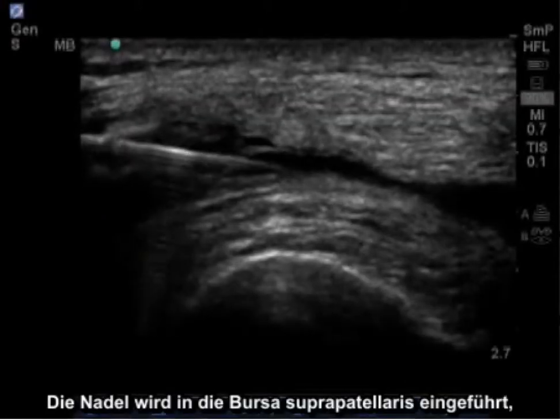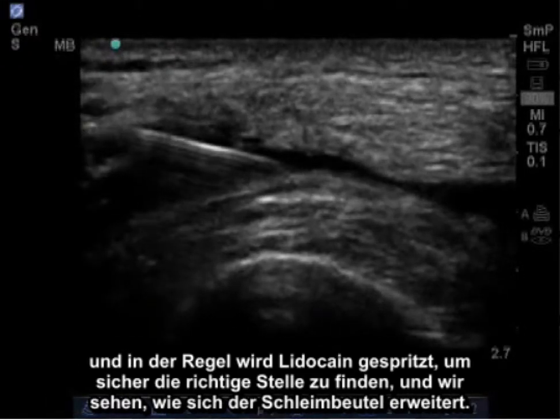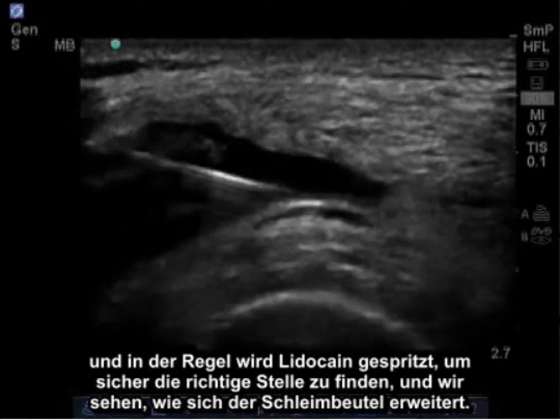The needle will be guided into the suprapatellar bursa, and lidocaine is typically injected to ensure proper location. We'll see the bursa expand.